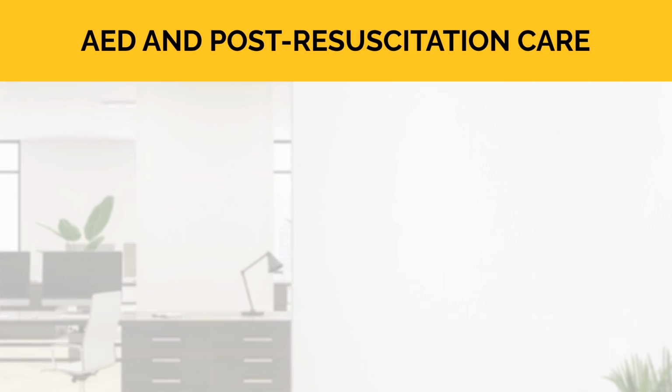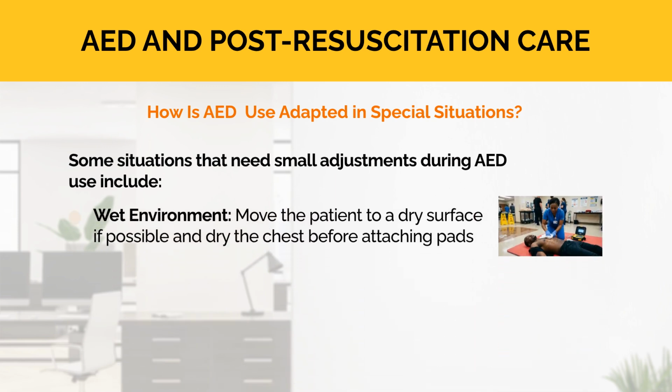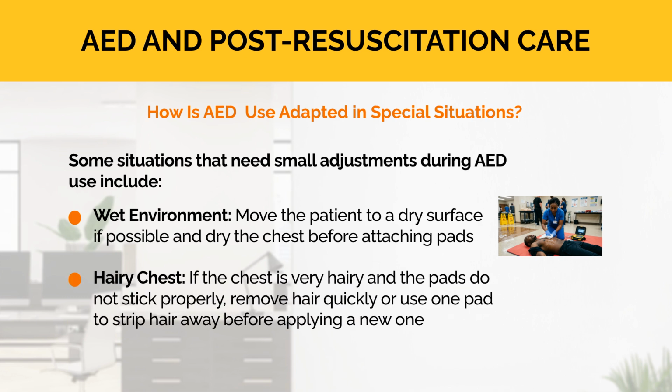Now, let's look at how the AED is adapted in special situations. Some situations that need small adjustments during AED use include a wet environment. Move the patient to a dry surface if possible and dry the chest before attaching pads. Hairy chest. If the chest is very hairy and the pads do not stick properly, remove hair quickly or use one pad to strip hair away before applying a new one.